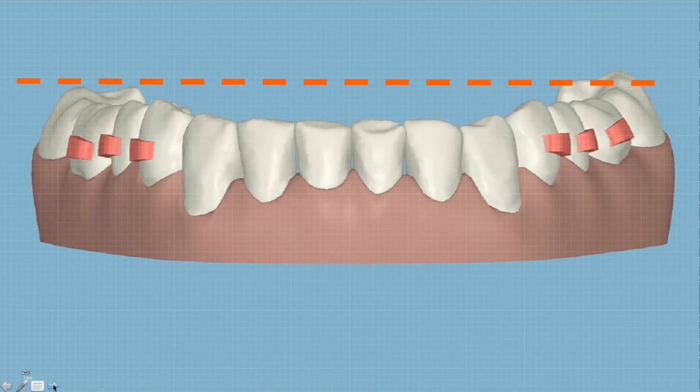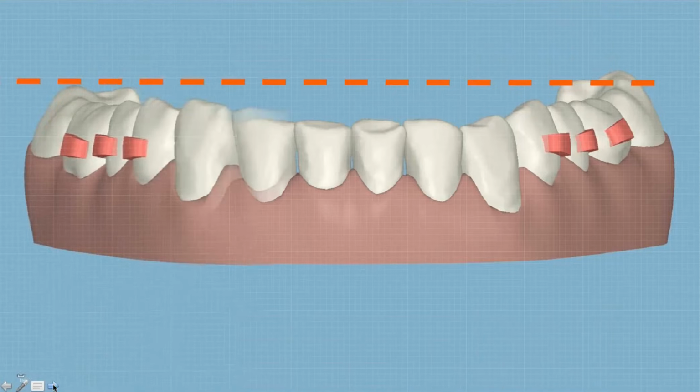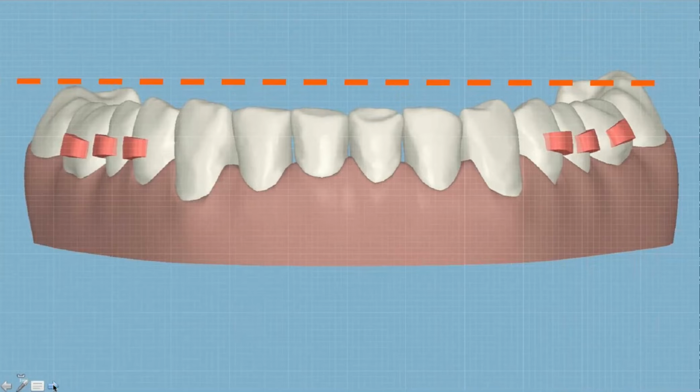But in reality, they didn't quite make it there by the last aligner, and they look more like this third picture. That is to say, they're not as far down as the ClinCheck anticipated they would be, and so now where are you hitting? You're hitting on your front teeth that are supposed to be lower and more intruded, but you can't get them there. And so now you're hitting on the front teeth, and your back teeth are not coming together.